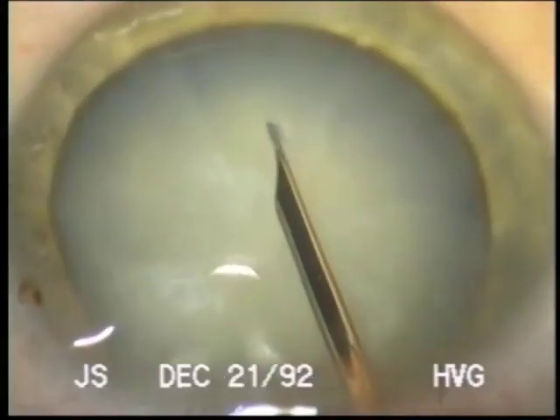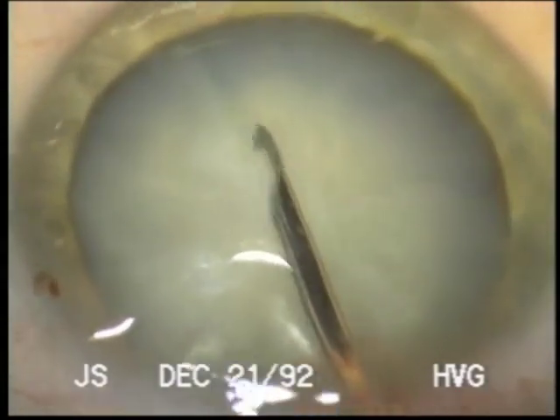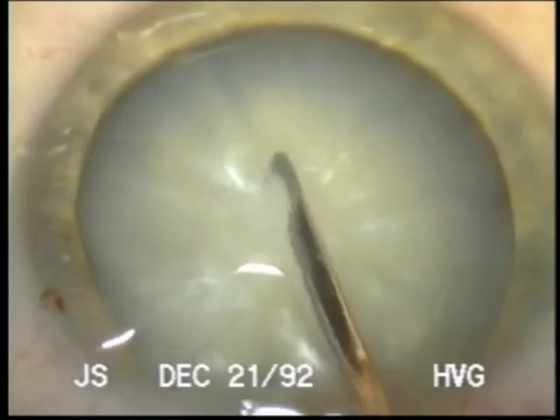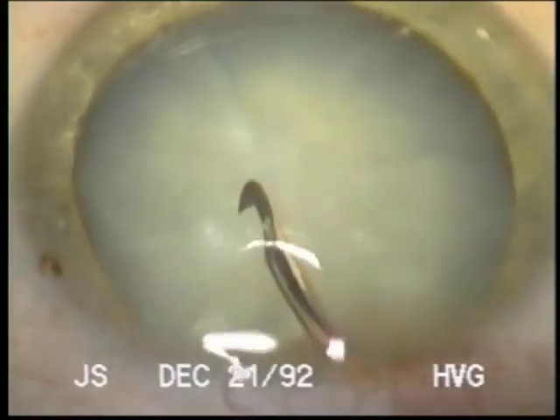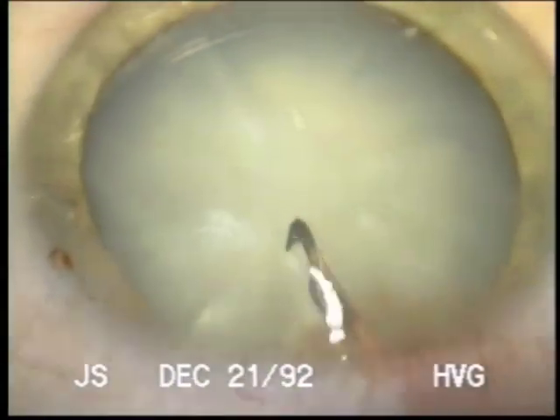Dr. Gimbel, this is an old case from 1992, before we had Vision Blue. I want to show the technique that I used, which we may have to use if Vision Blue is not available in some situations.